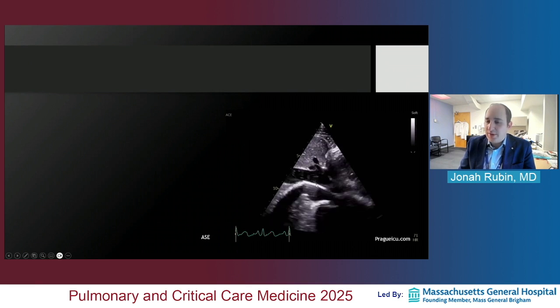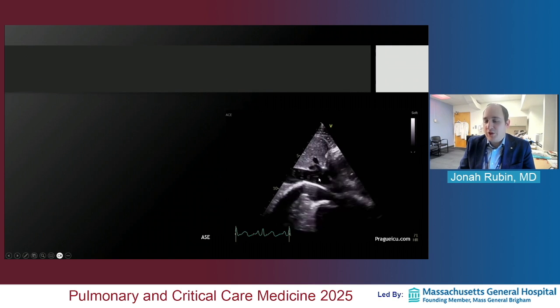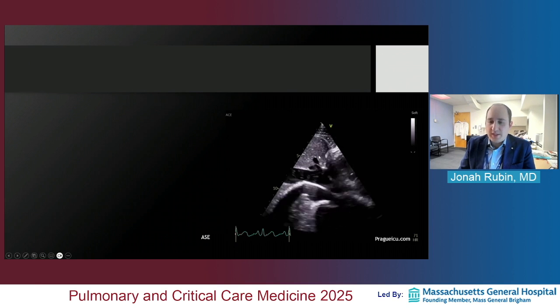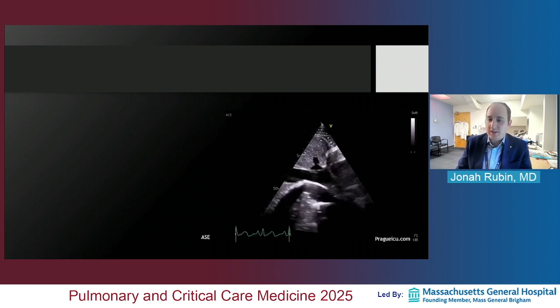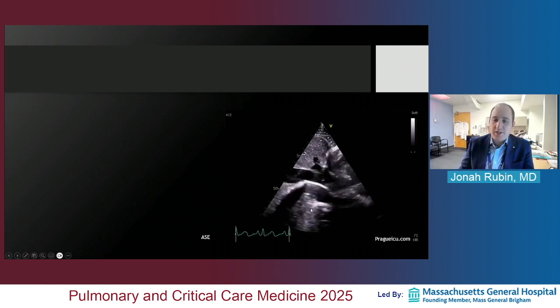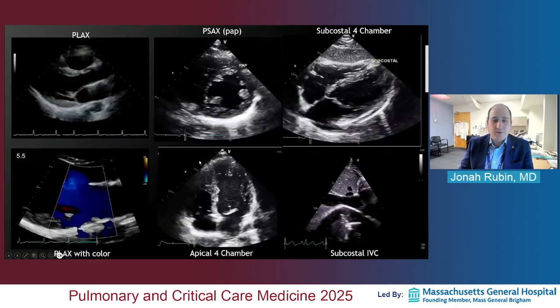I'm not a major fan of the IVC. If it's completely collapsed, that could generally be a sign of someone who might benefit from fluids if it's otherwise safe. There's really very little else that you can tell from a basic level from the IVC. It's extremely common for new learners to learn the IVC, because I think it's one of the easiest things to find, and start making claims about it. But there are a lot of really helpful articles that caution against all the mistakes that could be made from making volume status calls from the IVC on ultrasound. So I would hesitate and I would caution everyone against doing that.